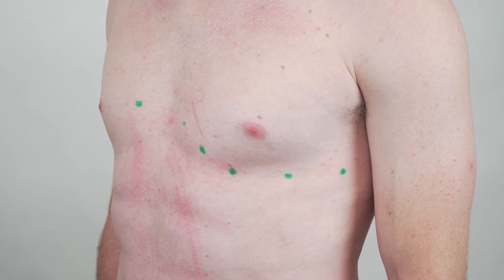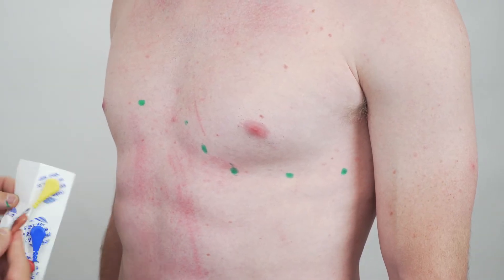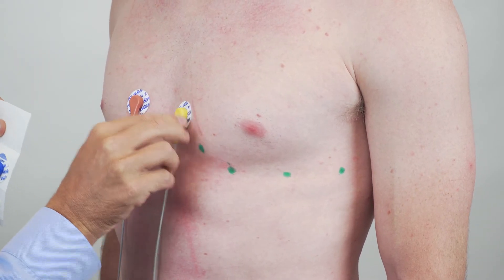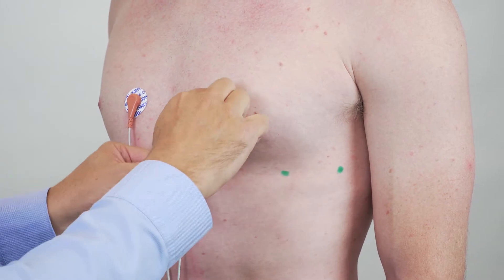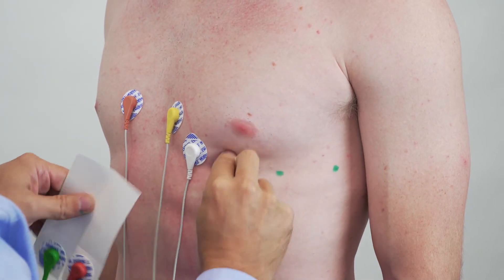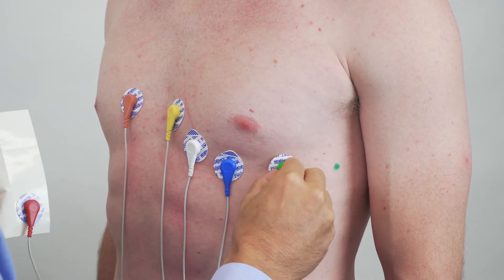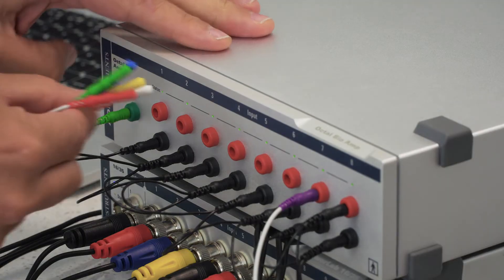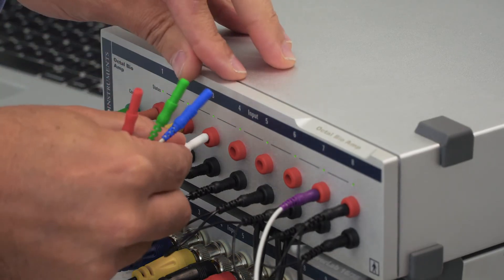Once I've found those spots I can stick on the electrodes — V1 on the other side of the sternum, then V3, V4, V5, and V6. Then we can take each of these wires and run them into the octal bioamp into channels one through six.